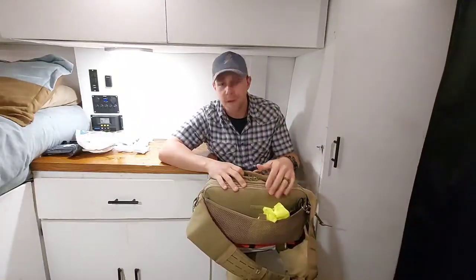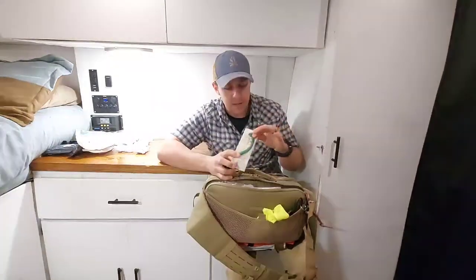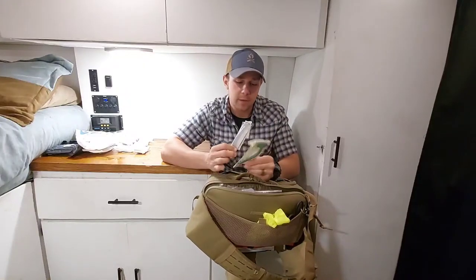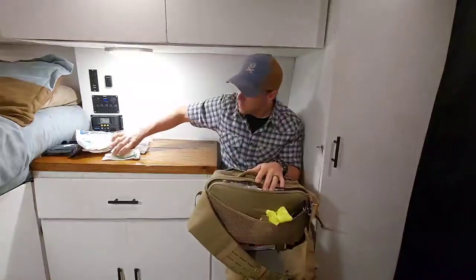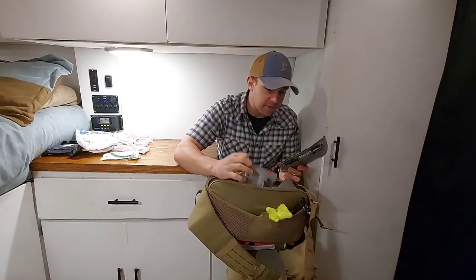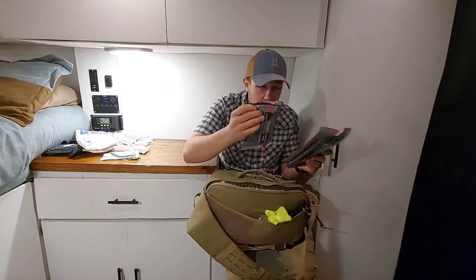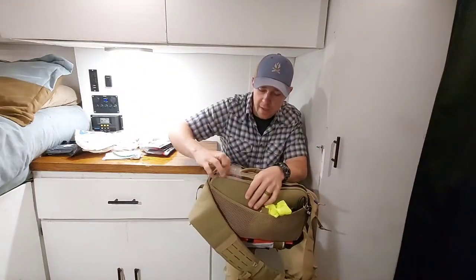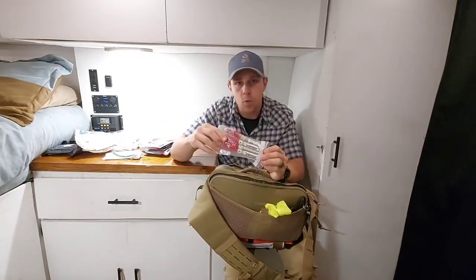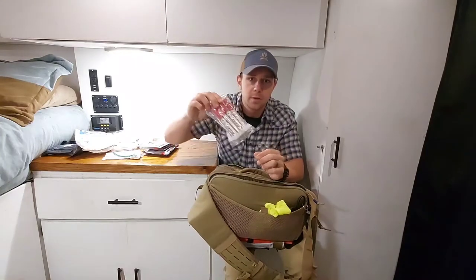Moving on to the back we have all of our airway and respiratory. We have quite a few NPAs with the lube taped on to the back ready to go — about eight of those. And then some HyFin vented chest seals. We also have ARS 3/4 inch decompression needles, the 14 gauge decompression needle.